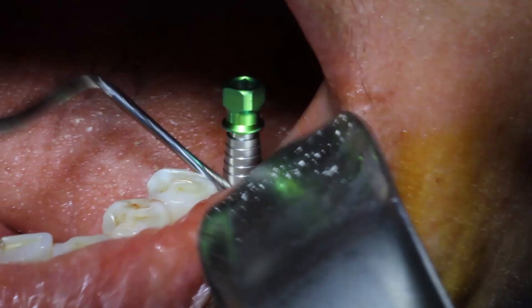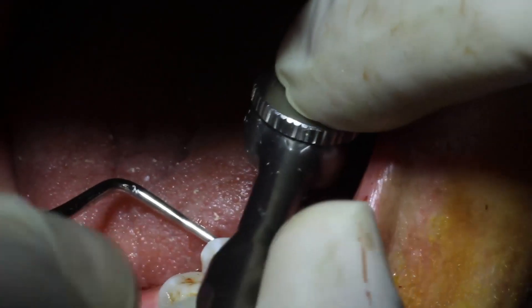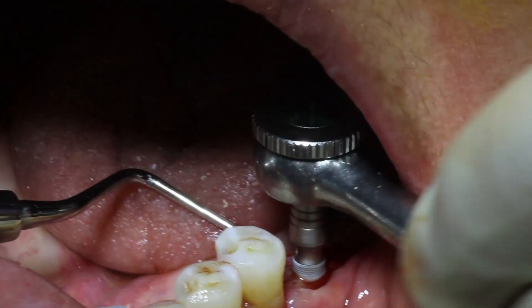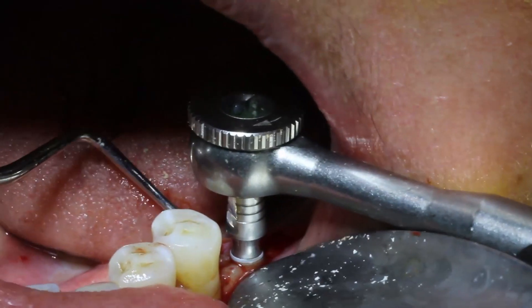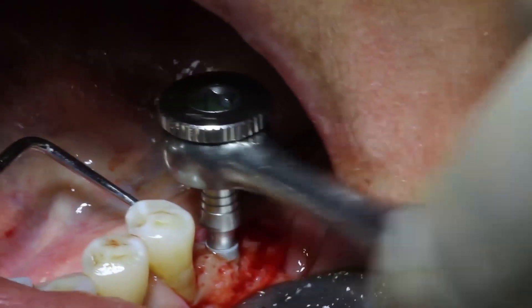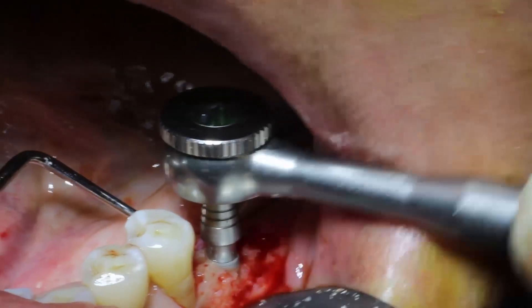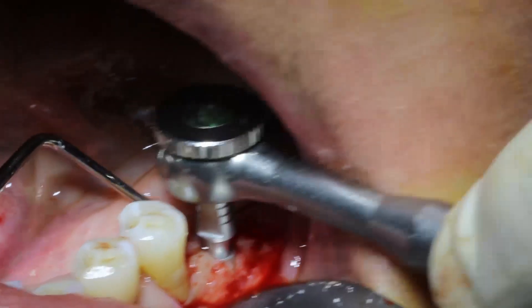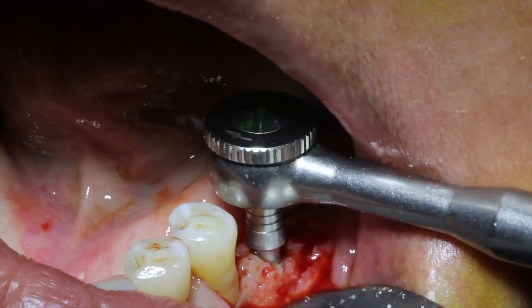Now you see me positioning my hand driver and I'm going to make sure to submerge that implant all the way until it's about a millimeter below the crest of the ridge. I'm just reflecting with my Minnesota retractor so you can see a little bit better. I'm taking it until all surfaces of the implant are below bone. The bone is going to be a little taller on the lingual than on the buccal — just make sure that won't be a problem when you try to take impressions.